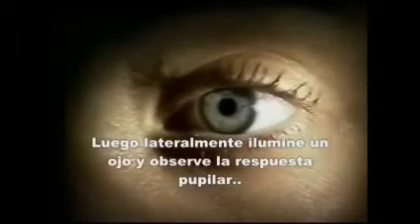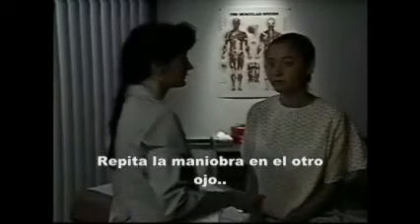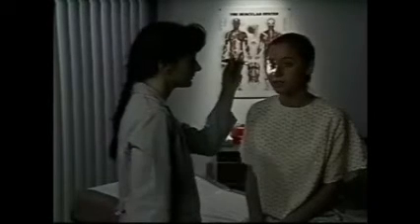Then, from the side, shine a bright light into one eye and observe its pupillary response. The pupil should constrict briskly in direct reaction to the light. Now shine the light into the same eye again, but observe the pupillary reaction of the opposite pupil. It should constrict briskly in a consensual response. Repeat the process with the other eye. Watch for direct and consensual pupillary reactions again.